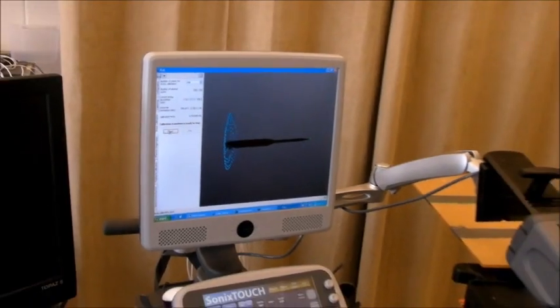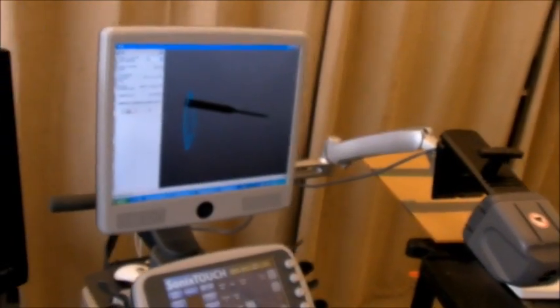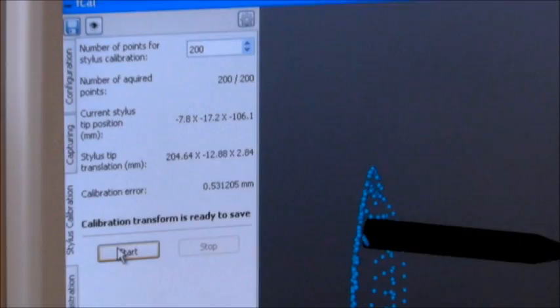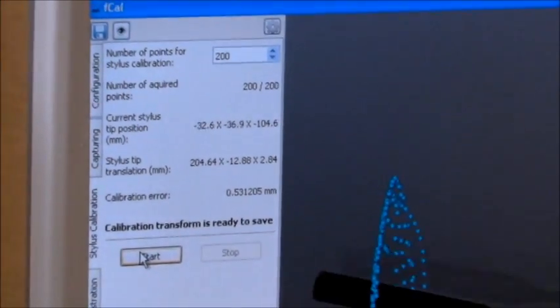Yes, it's done. As you can see, the tip point is computed. The error is about half millimeter.